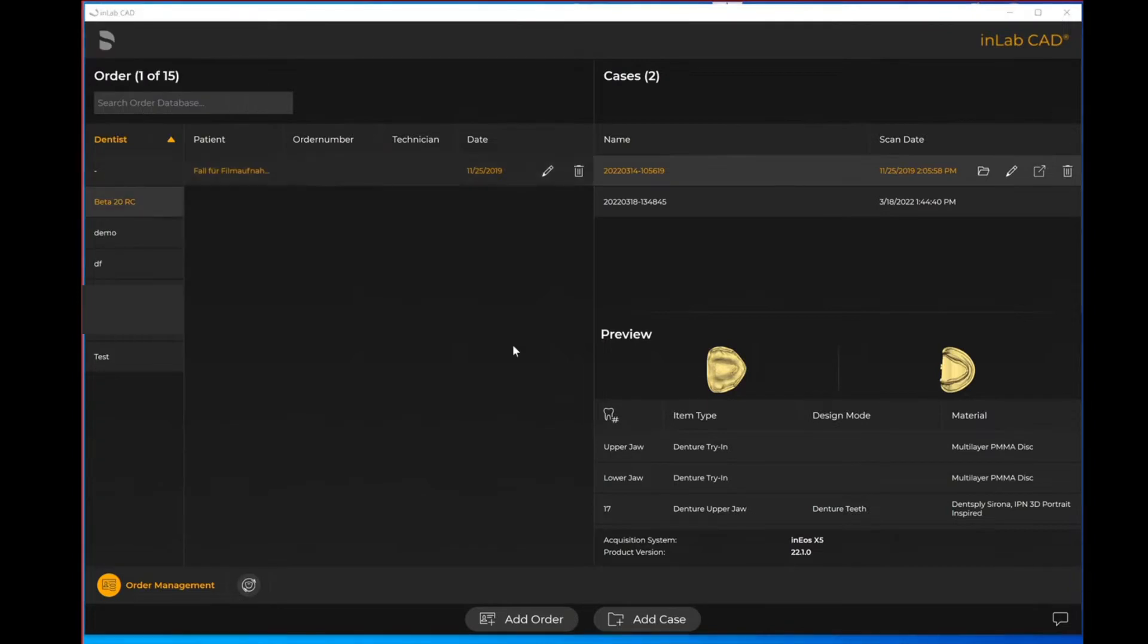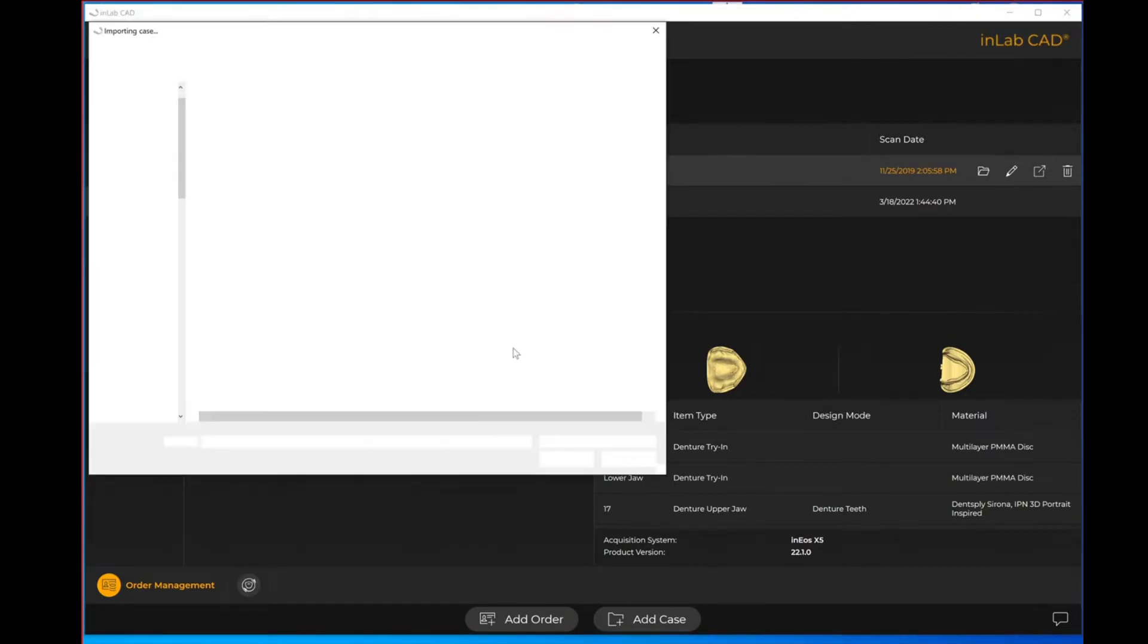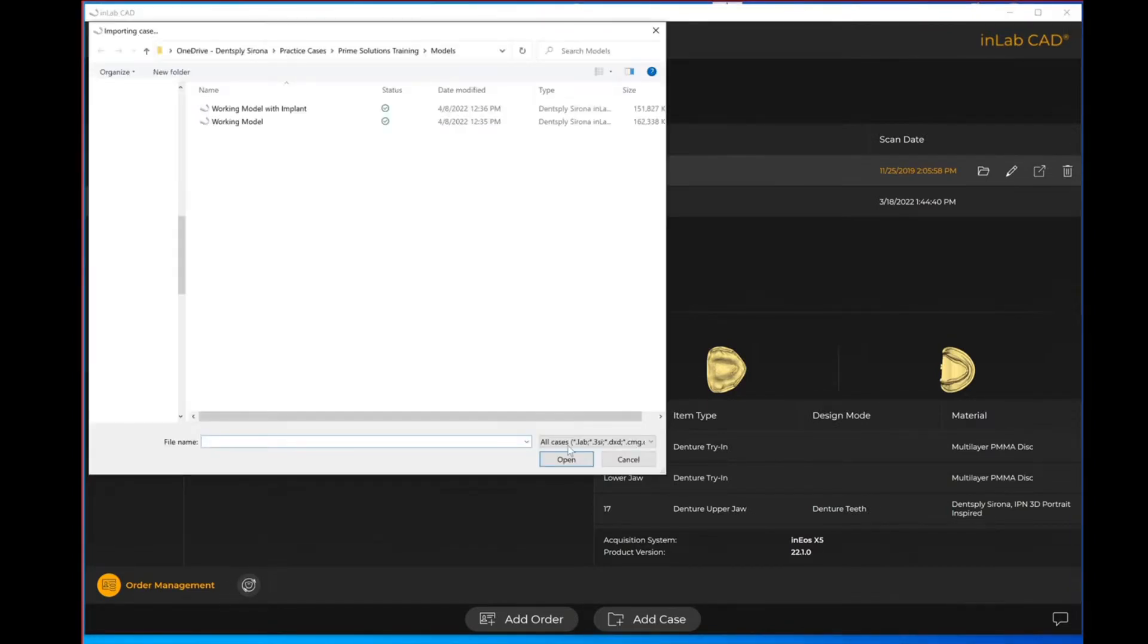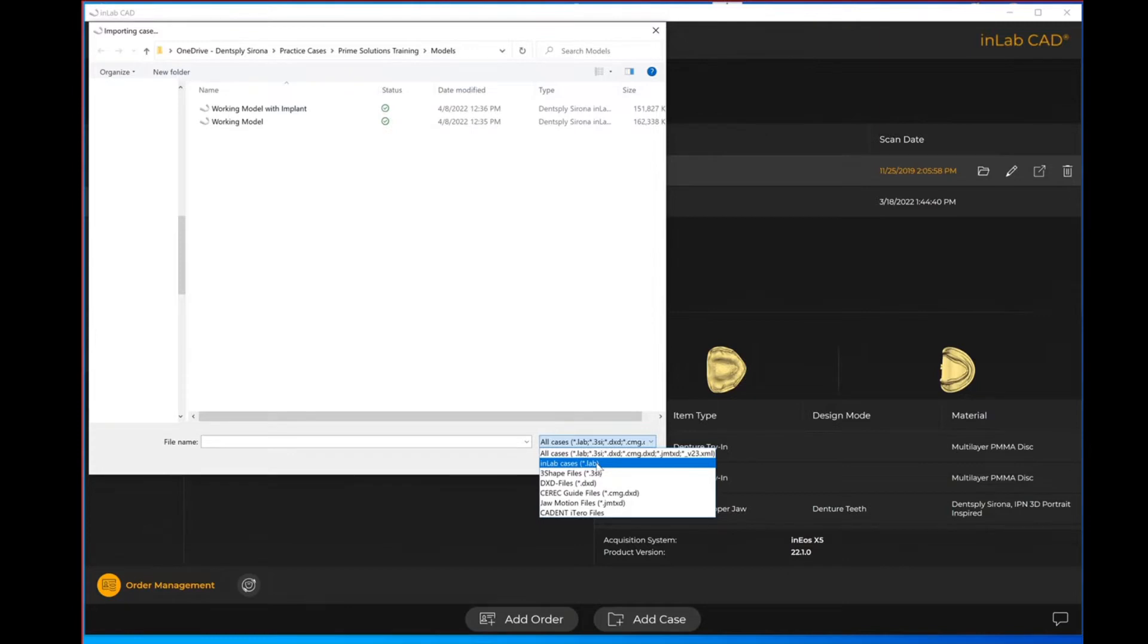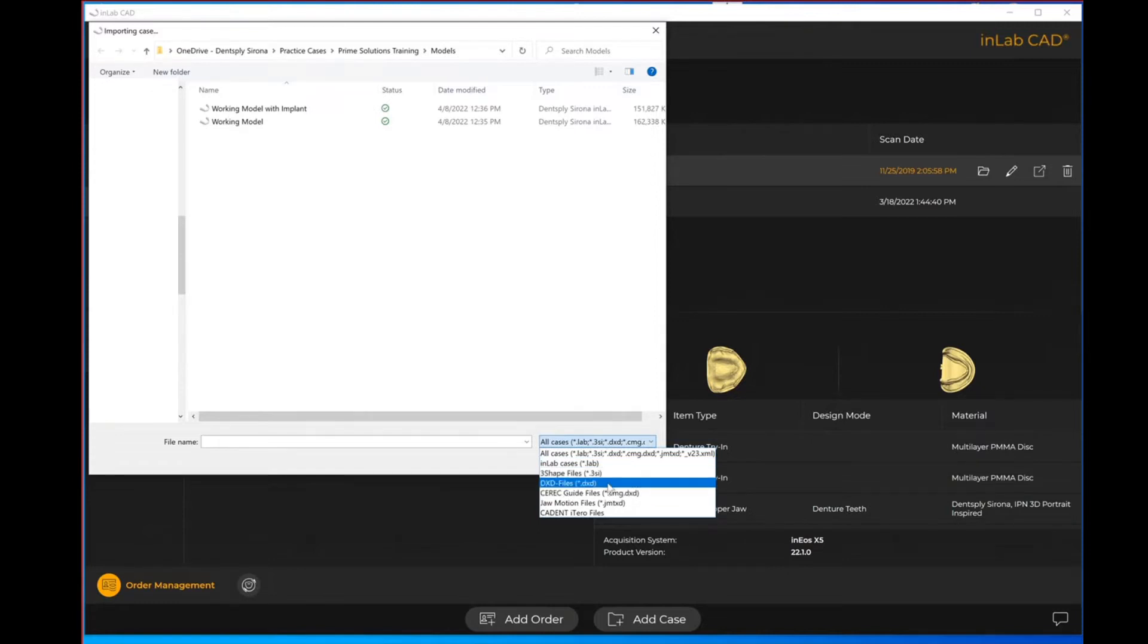I want to show you that in addition to STL files, you do have the ability to import a dot lab file. That's if you are getting another file from another inLab user. You can also import a 3Shape file known as a dot 3SI.